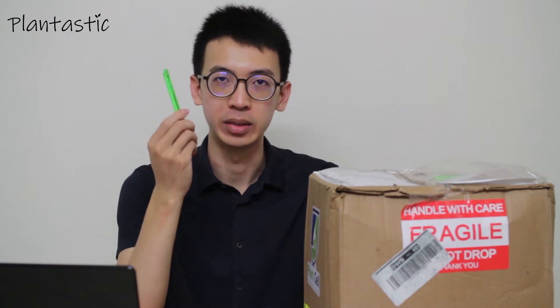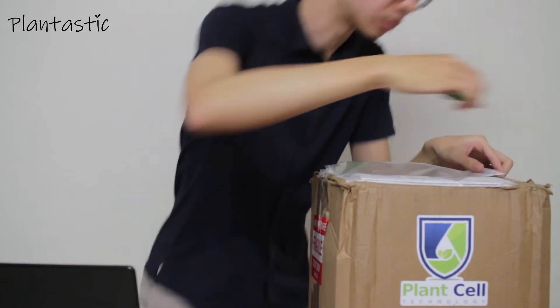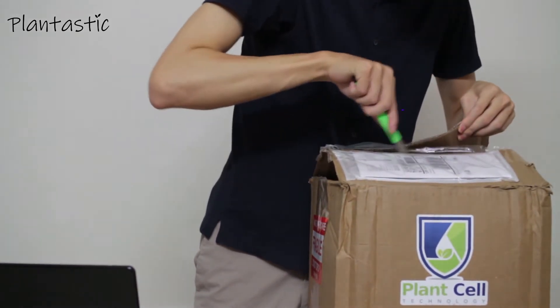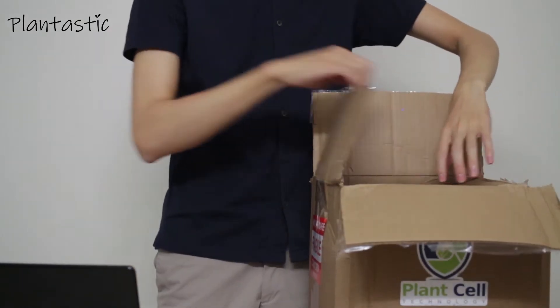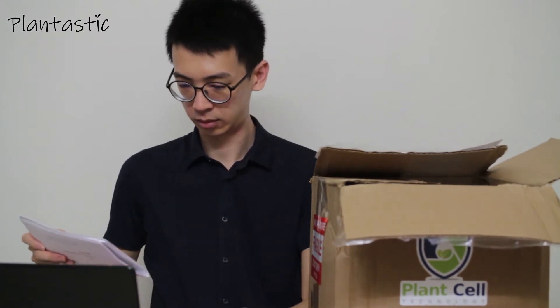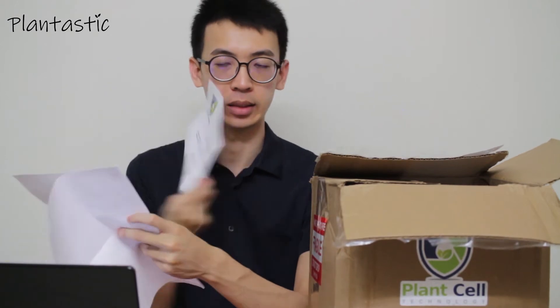So let us start the unboxing video. You will get a document from them. Let us see what is inside. Basically they have the certification of analysis of the chemicals.